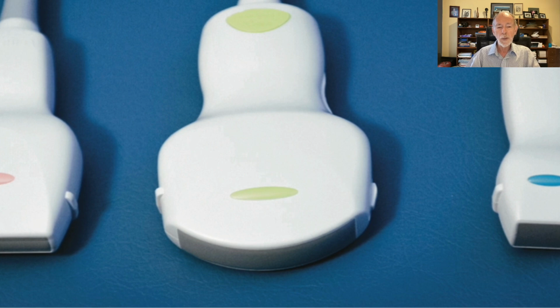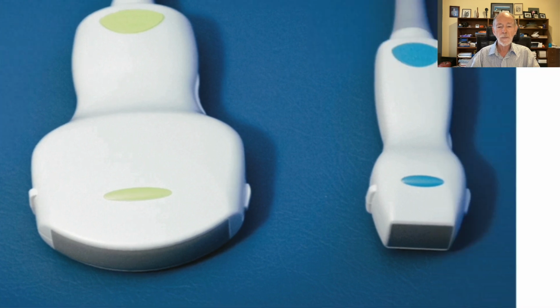The curved probe has an advantage in that it produces a wider field of view, so it covers a broader amount of anatomy in a single image. But because of the curved face, it needs to be pushed into the patient's tissues sufficiently to get contact over the entire surface area of the probe. And that's the entire grey area that you see in this photograph.